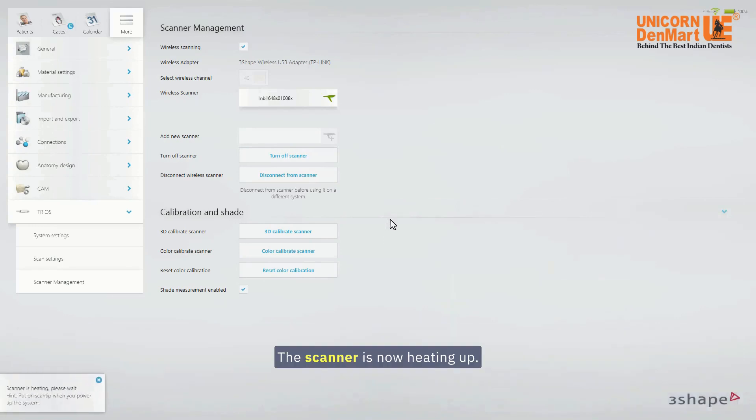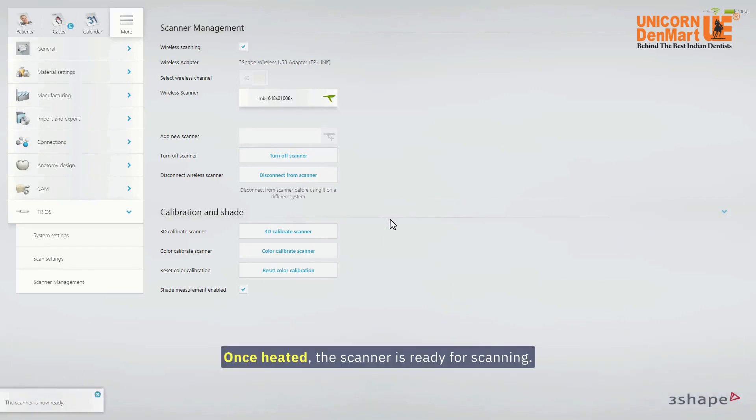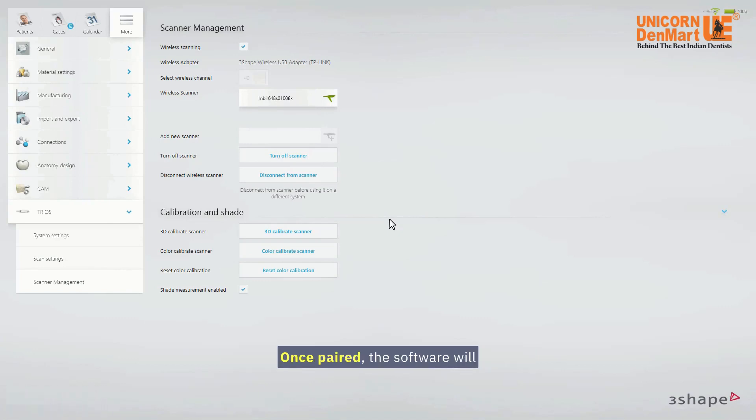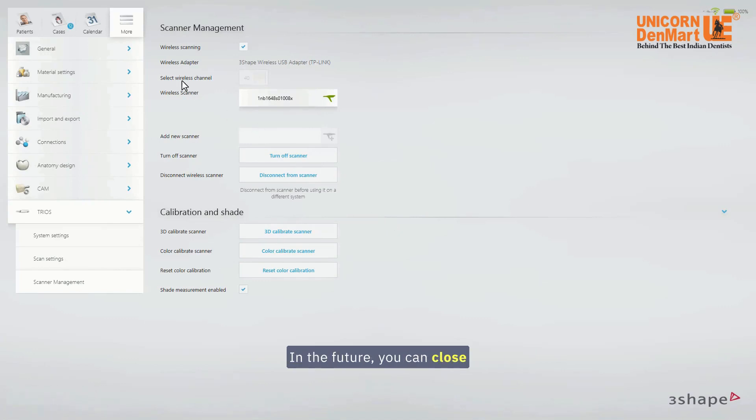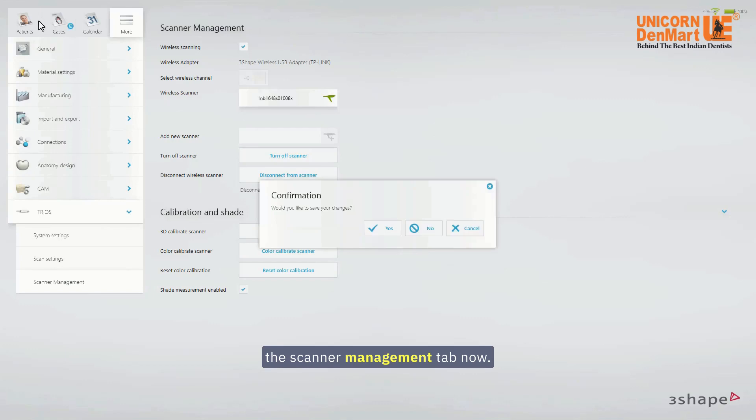The scanner is now heating up. Once heated, the scanner is ready for scanning. Once paired, the software will automatically connect to the scanner in the future. You can close the Scanner Management tab now.